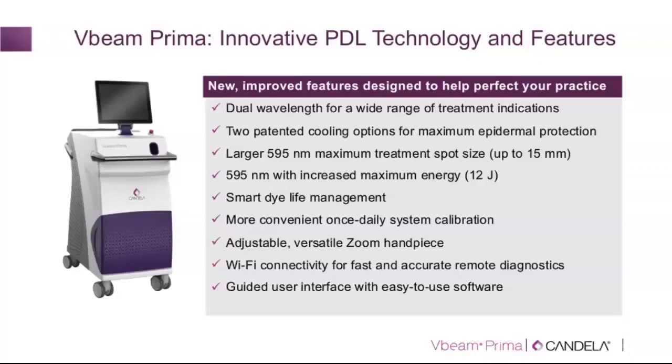Some repetition questions on the contact cooling and on the large spot size, the dye. The dye is the same, so it is the same rhodamine dye, but it is more efficient compared to the Vbeam Perfecta in terms of lifespan. So the dye life is longer, and you are able to track how much dye there is left with a monitor tracking system.